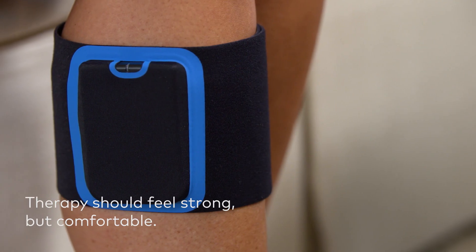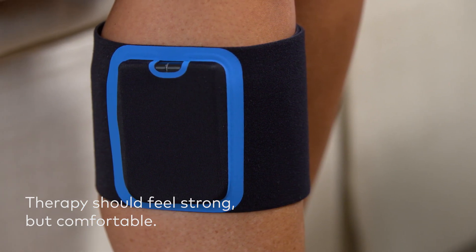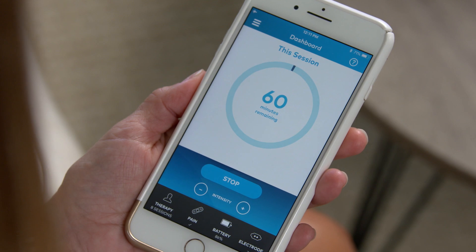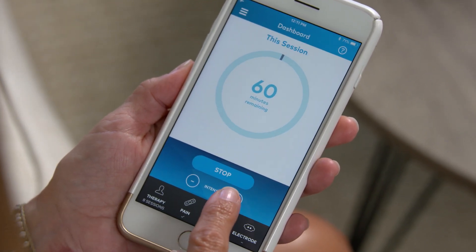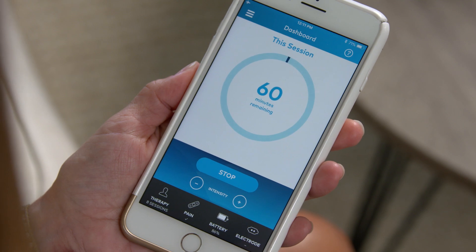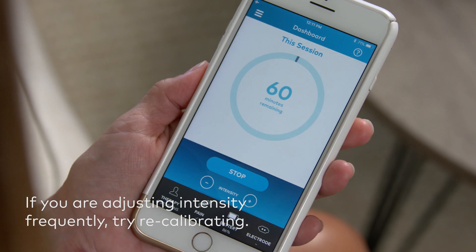Calibration should set your therapy intensity to the optimal stimulation level for you. Therapy should feel strong but comfortable. Once therapy has begun, the intensity will increase over the first two minutes until Quell reaches your personalized level. If at any time you feel stimulation is too strong or too weak, you can adjust the stimulation level up or down while you are in therapy within the app. If calibrated appropriately, you should not need to adjust intensity often. If you find you are changing intensity frequently, try recalibrating.